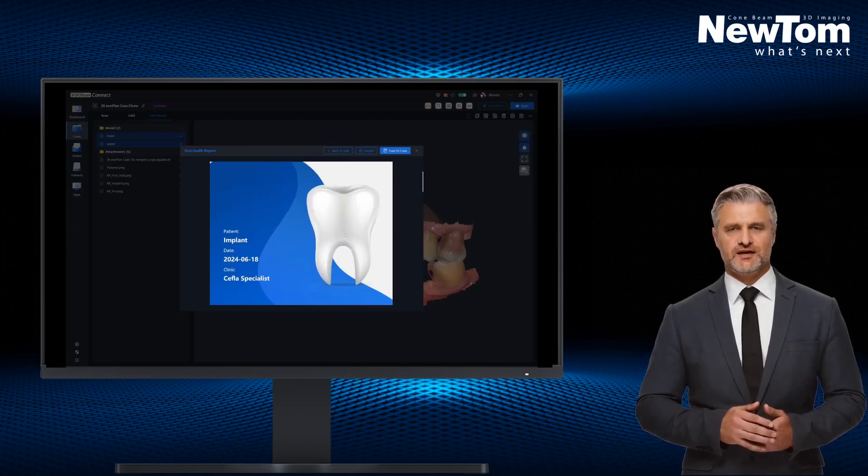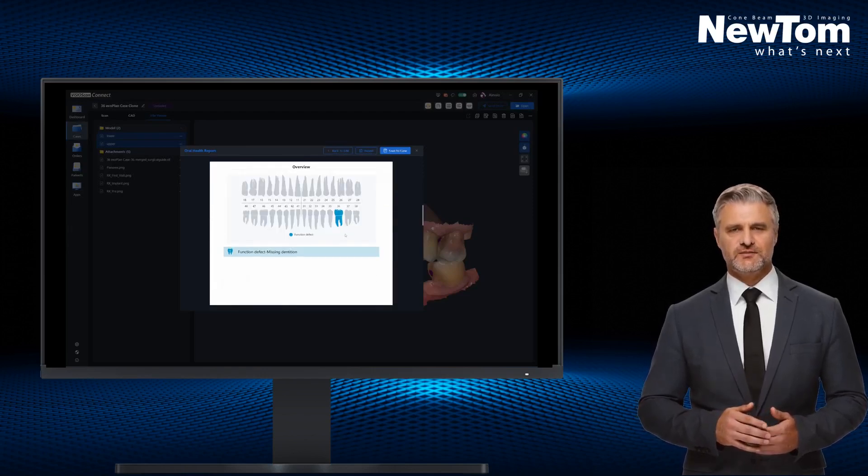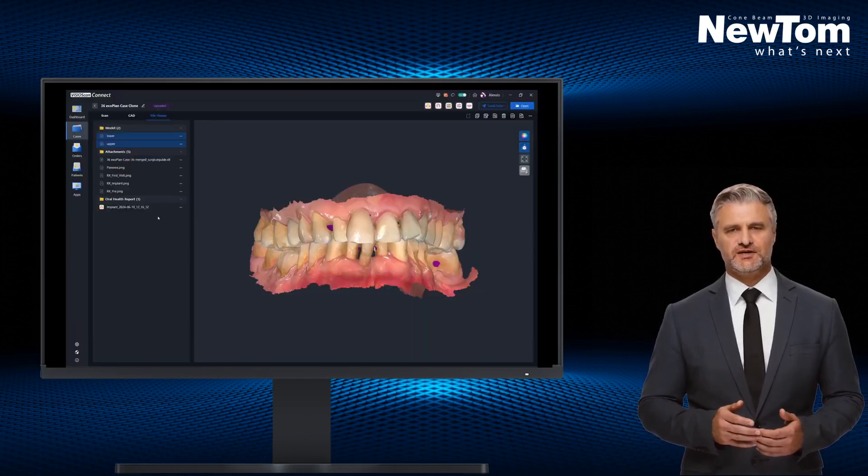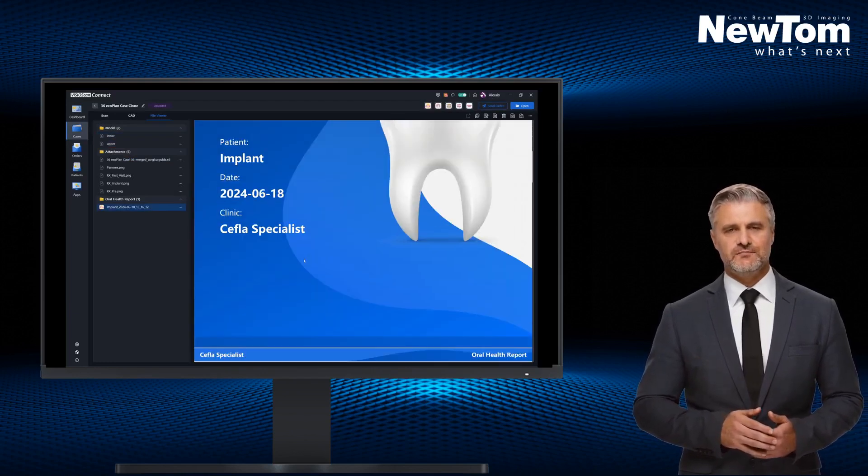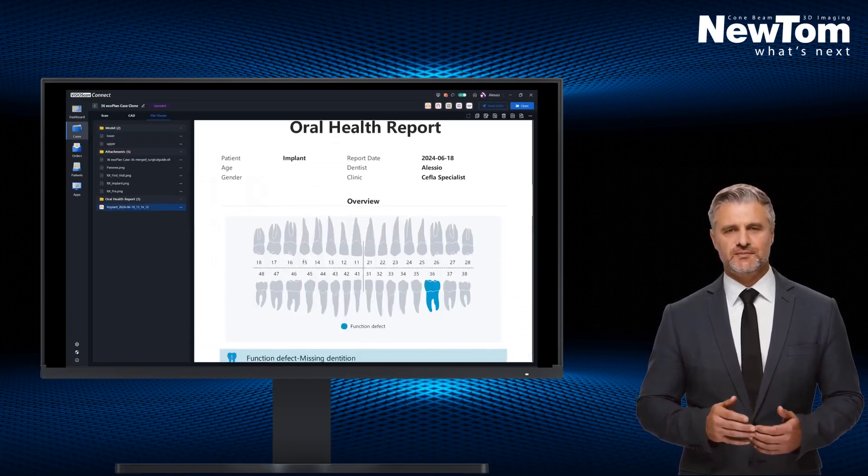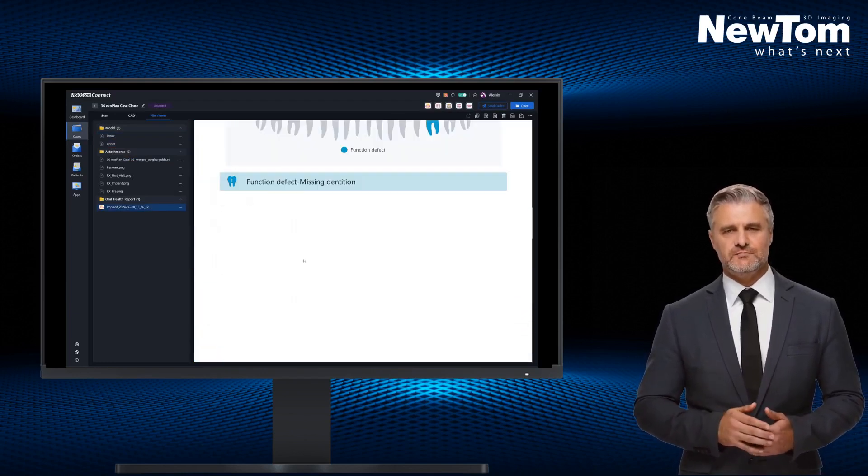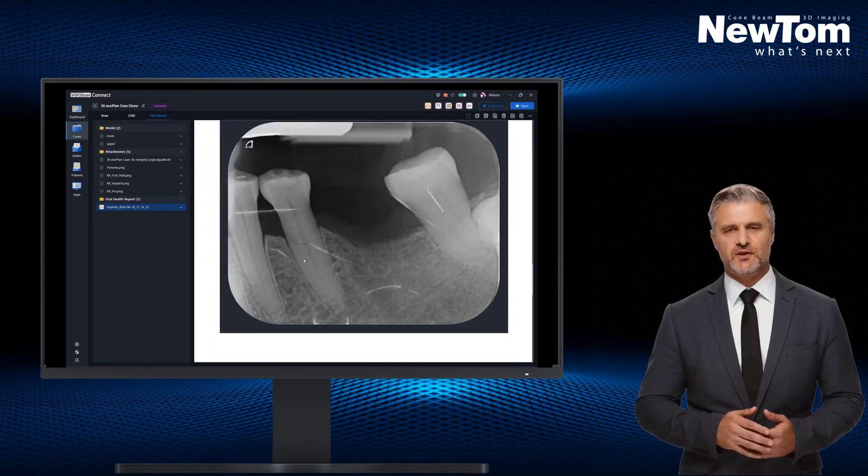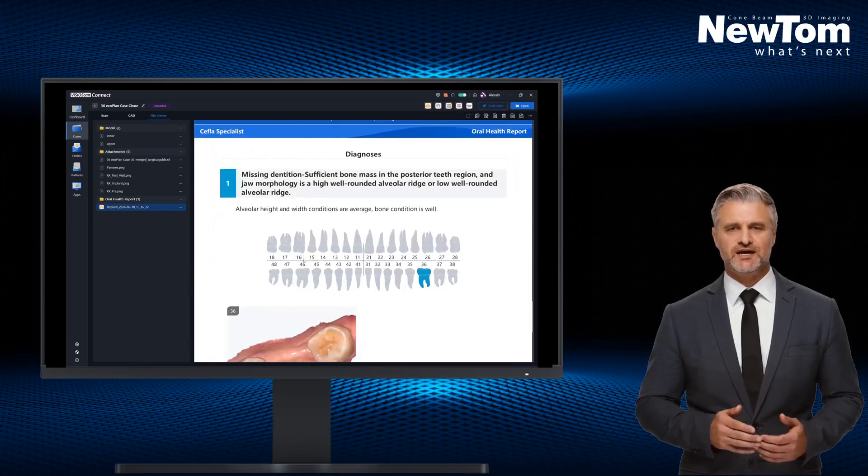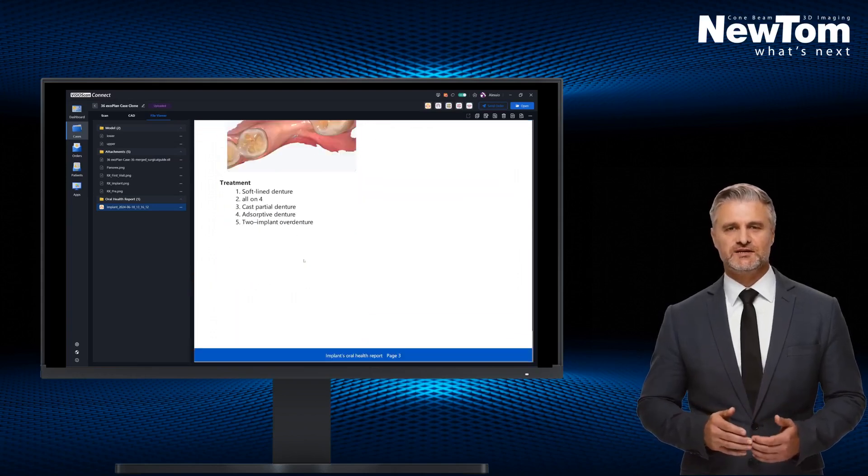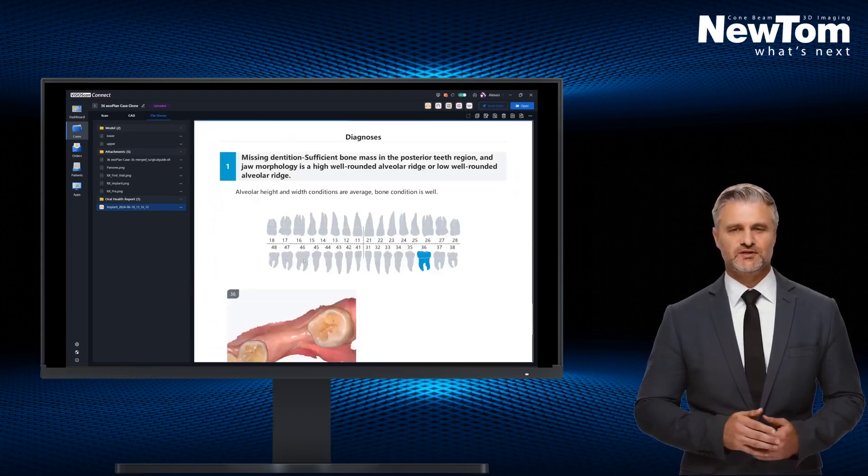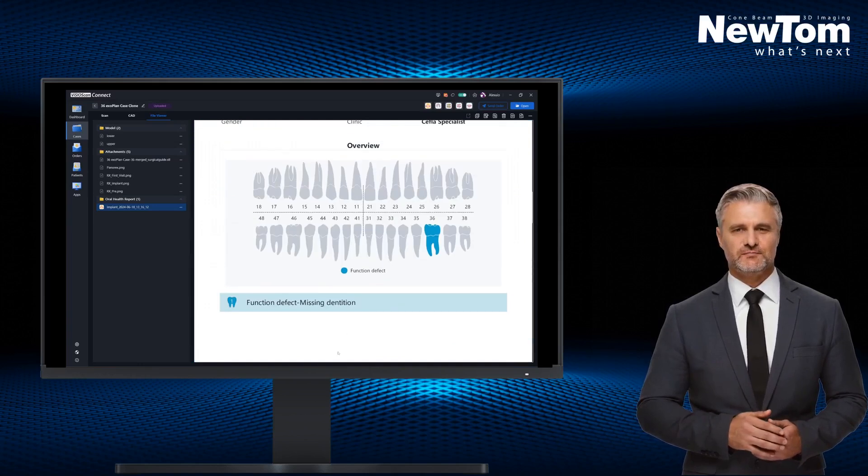The document can be used to present the treatment to the patient or the laboratory, even for remote communication. The software will include in the report the images of the highlighted area, the diagnosis, and a proposed treatment plan.